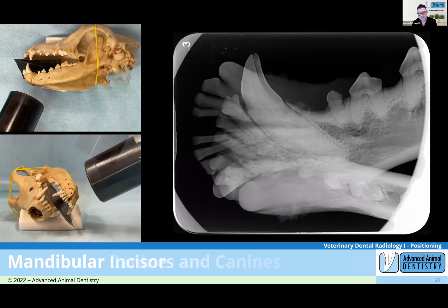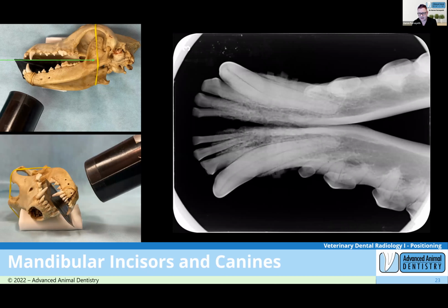Yeah, which actually brings in this interesting point that I've always thought about with dental radiology. With all other radiological views we take around the body, we will never settle for one shot, and we shouldn't settle for one shot. With teeth, sometimes we only get one shot, but as Bex indicated, the more shots you actually get of it, the more information you have. So it is valuable where you can. And yes, it takes time, but certainly if there's anything just niggling at you that it's not right, take a different view. Yeah. Absolutely.